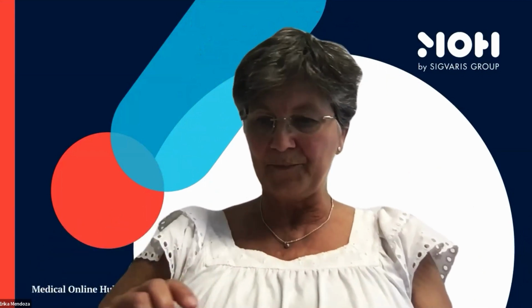If you want to see it, I again invite you on the 21st of September, I will do that and show it. You can make a drop and it's like a globe, but it's so hard that you can really see it moving slowly inside the vein. I would only apply 1 ml. Then I will take 1% for the rest of the saphenous tributary.